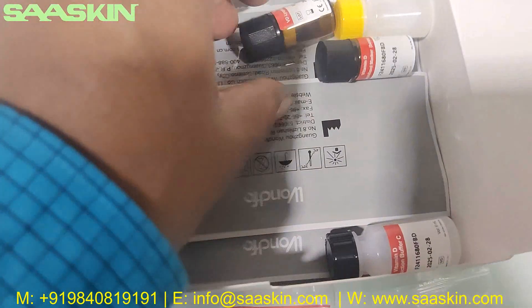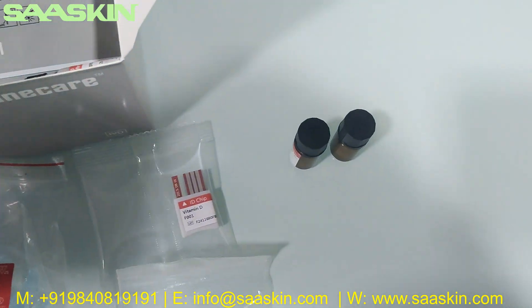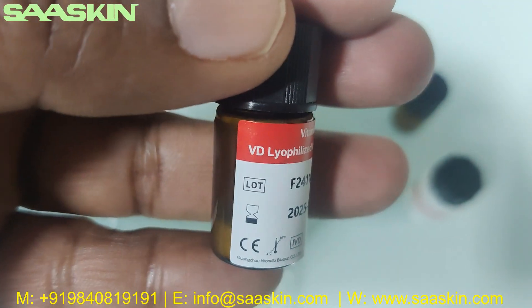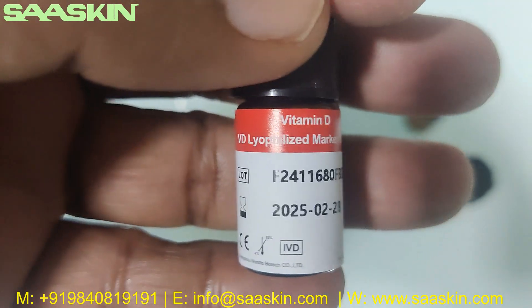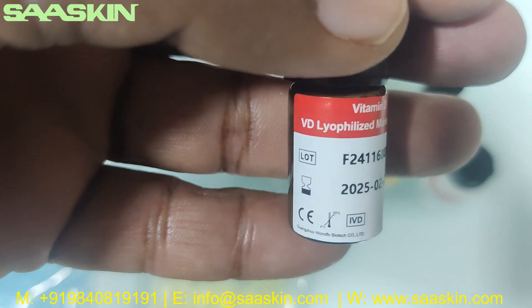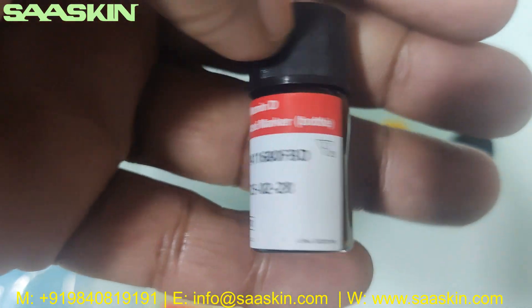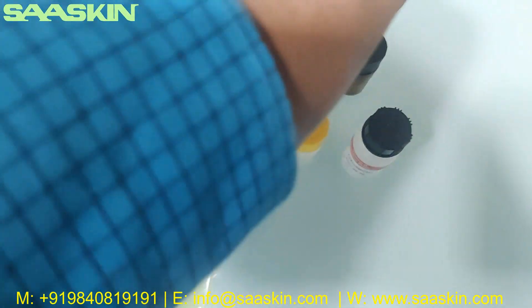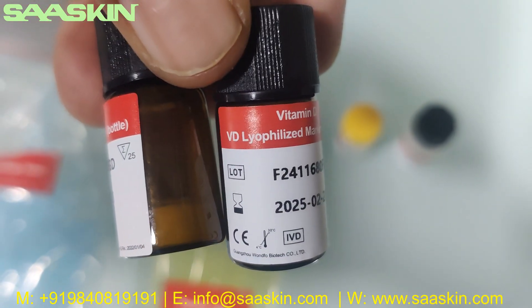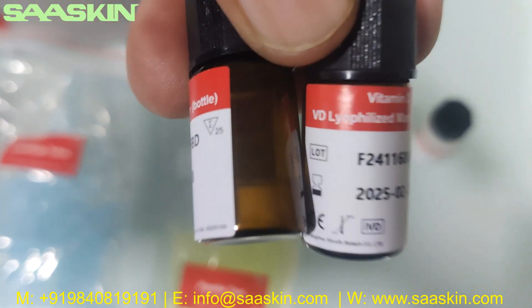You also get bottles — let me pull out the bottles here. Look at this: this bottle is a VD lyophilized marker bottle — Vitamin D, VD lyophilized marker bottle. You can see this here. It also has the lot number and expiry period. There are two bottles of this — two bottles of the VD lyophilized marker for the vitamin D test.